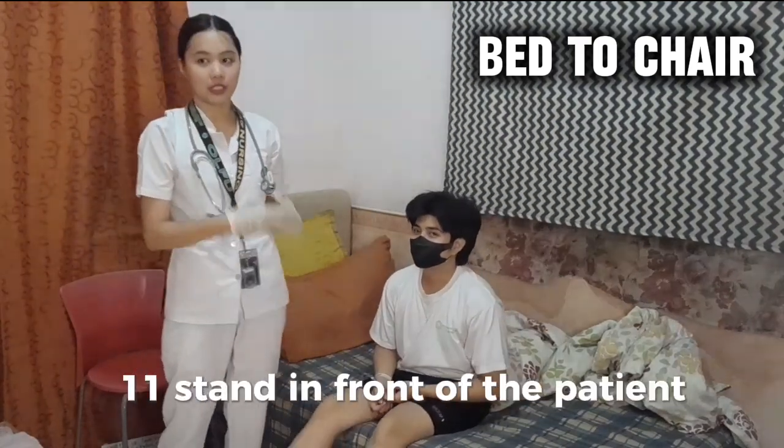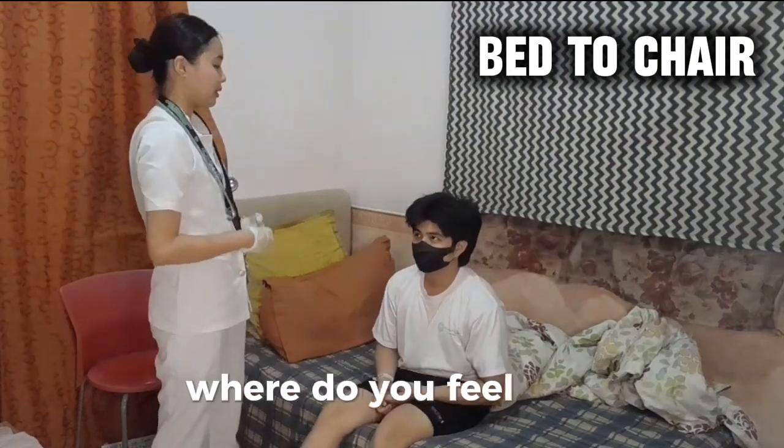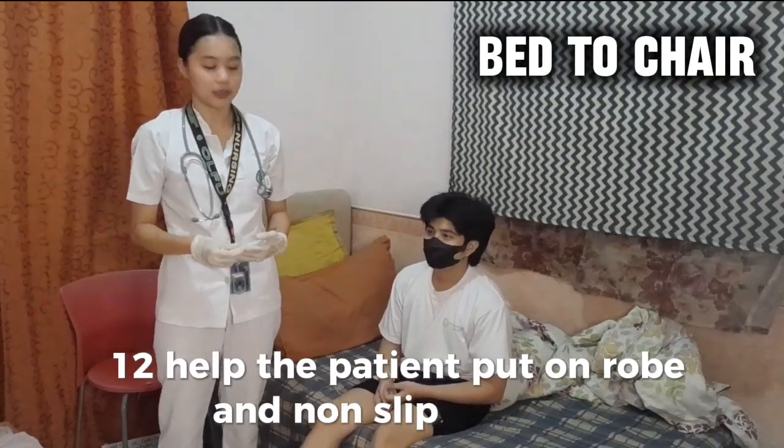Eleven, stand in front of the patient. Ask them if they feel dizzy, then let their legs dangle for a few minutes. Sir, do you feel dizzy? Okay. Number twelve, help the patient put on robe and non-slip slippers.